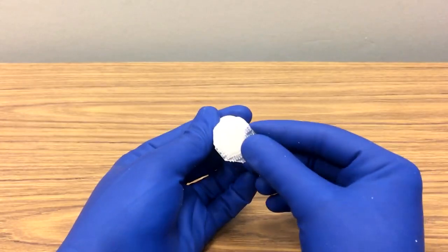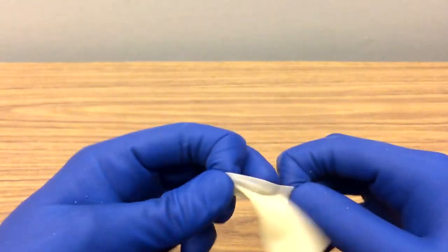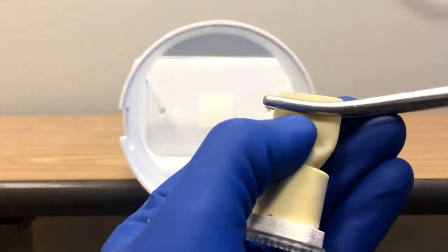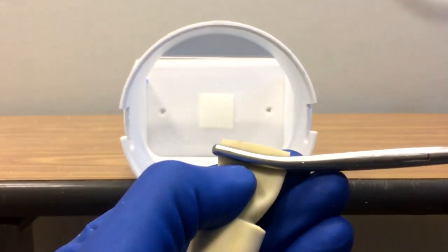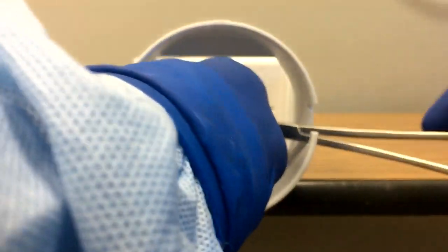For task 3, a square fastener is attached to the half-inch plug. A 5/8 inch Penrose drain is cut to 5 centimeters and placed over the plug. The hysterectomy clamp is positioned, leaving about 2 millimeters of drain distal to the clamp, and the insert is placed into the model for either left or right-sided suturing.